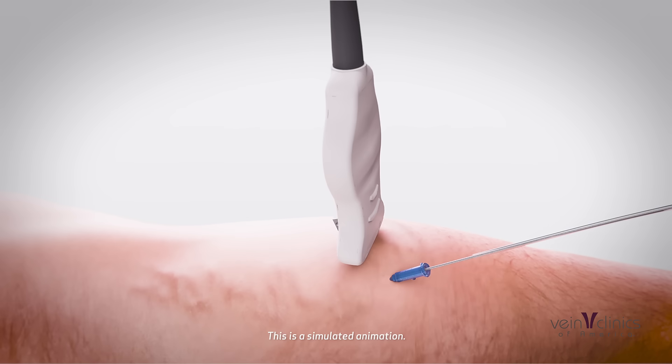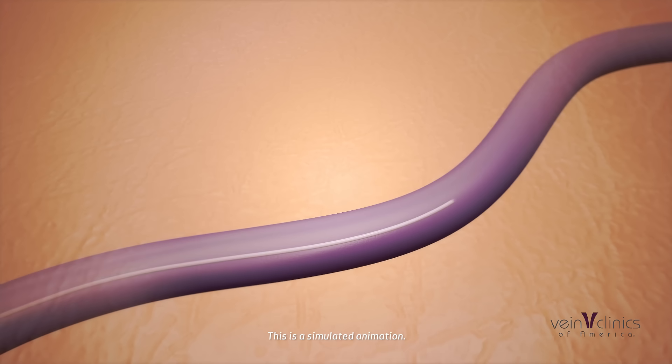Then a sheath is inserted along the guide wire and fed through the vein. The guide wire is removed, and the doctor gently places a small radiofrequency fiber inside the sheath into the vein. Radio wave heat is delivered to heat and collapse the targeted vein.